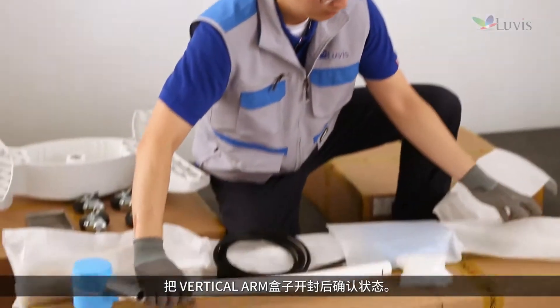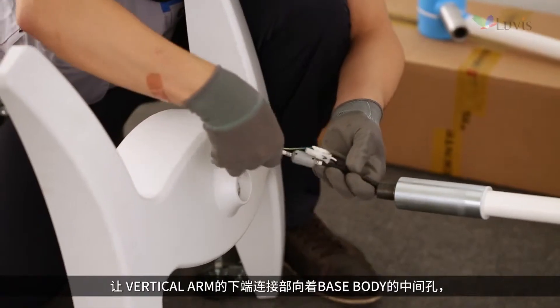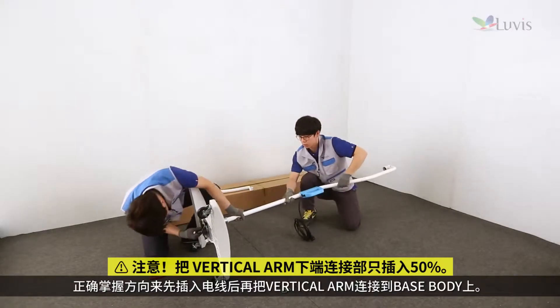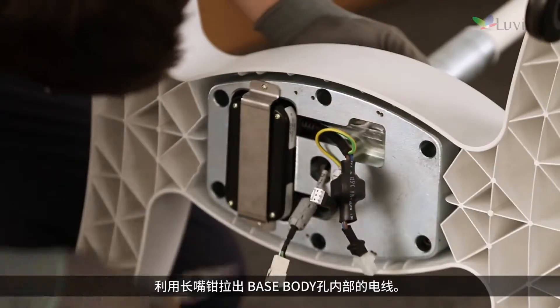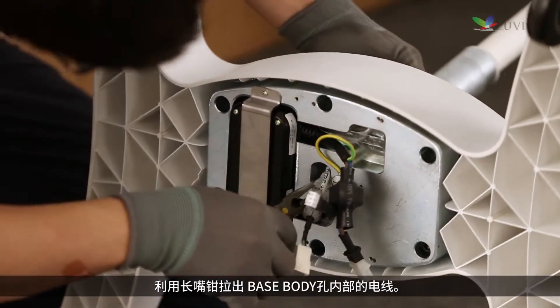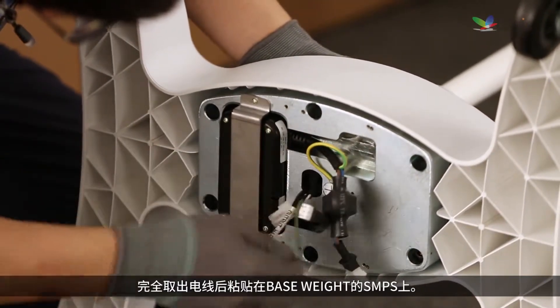Open the vertical arm box and check its status. Make the bottom connection part of the vertical arm face the center hole of the base body. Insert the wire first, then connect the vertical arm to the base body. Pull out the wire from the base body hole using long-nose pliers.